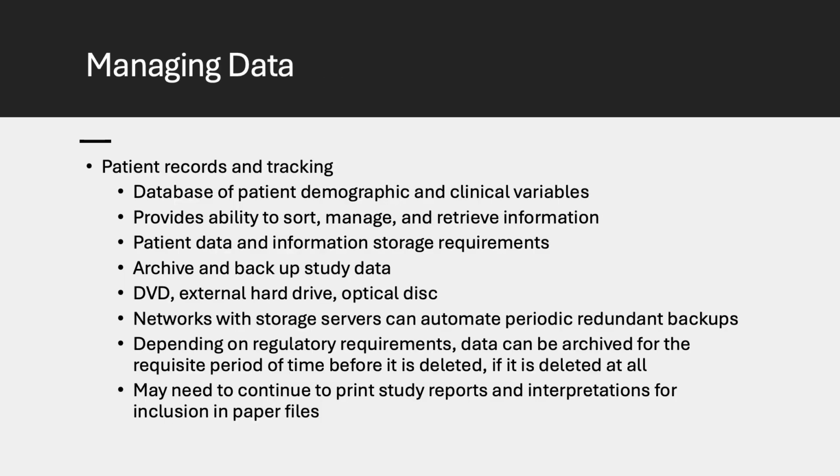Not only do we record PSG data, we have to keep accurate records and archives of the raw data. Typically, there is a database of the patient's demographic and clinical values. A lot of the times it's the EMR. There is also a log of the studies that are run. Sometimes all this can be imported into the PSG system, allowing for seamless transition from provider to provider.